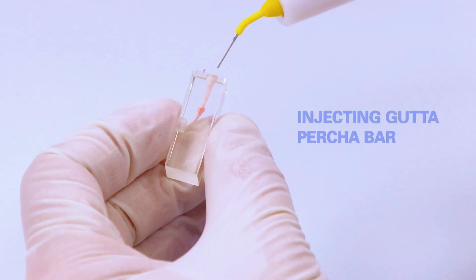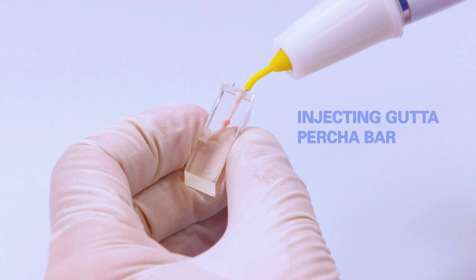Injecting gutta percha. Prevent overfilling.